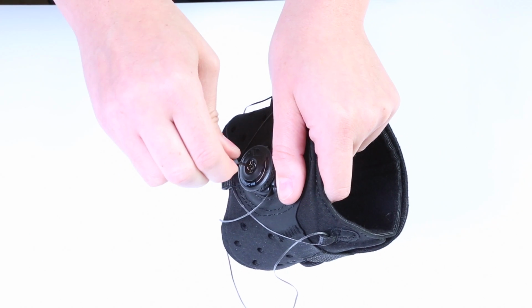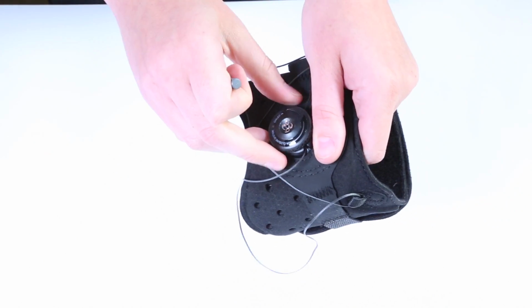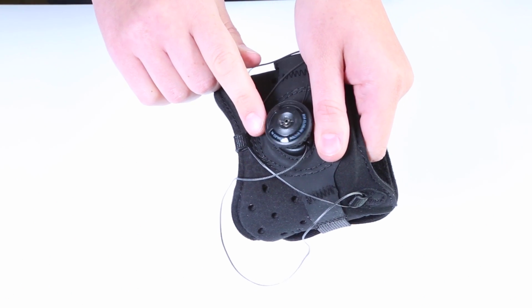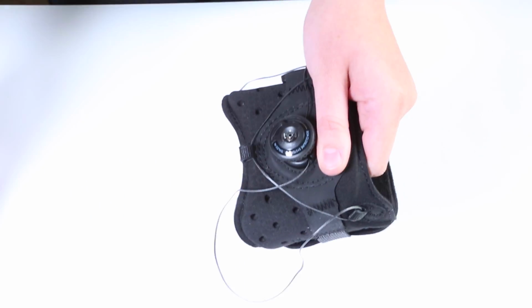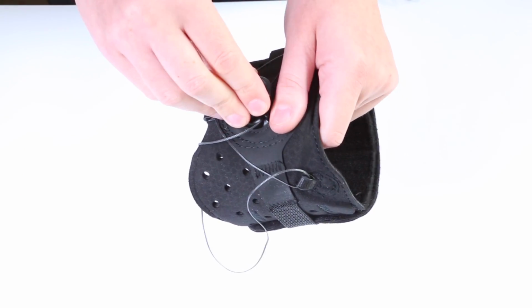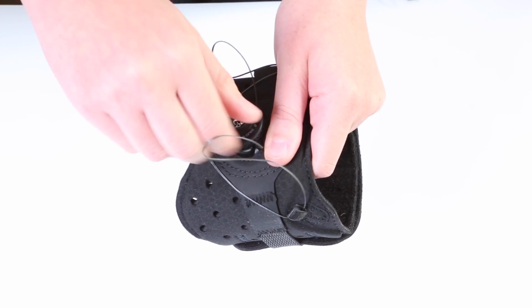I'm going to do a little quarter turn backwards because I want to make sure that this BOA dial is perfectly on there. So I'm going to test it. It wiggles just a little. So I'm going to tighten it up some more. All right, so now I think that's pretty good. So I'm going to tighten that Spectra cord.